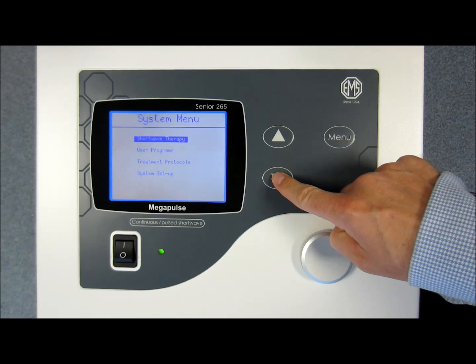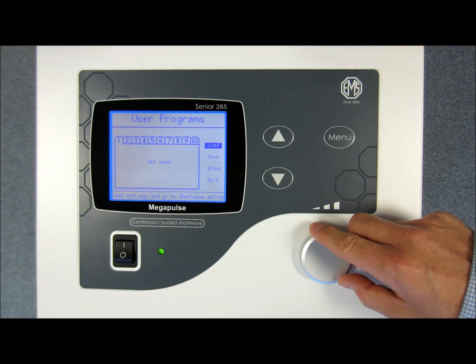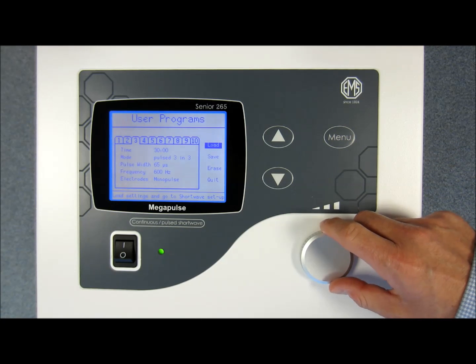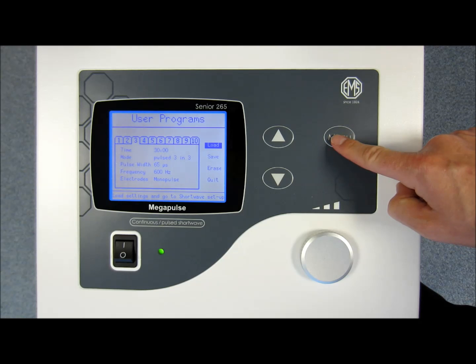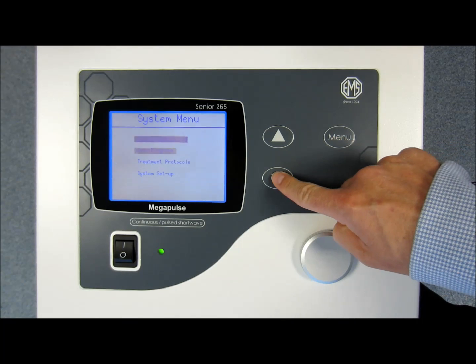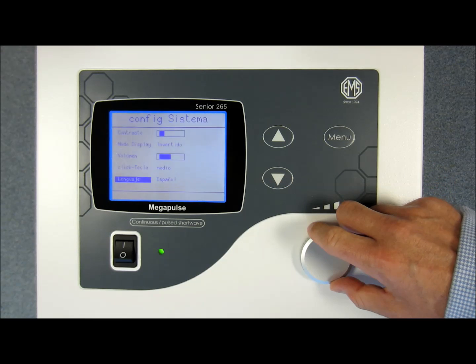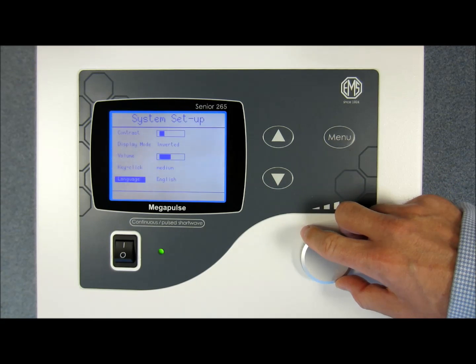If you have a number of preferred settings you wish to save, the Megapulse Senior allows you to save up to 10 different settings of your own choice for easy access when you need them. If you prefer, the device comes in several pre-programmed languages including English and Spanish, but please do see your country dealer for specific details.